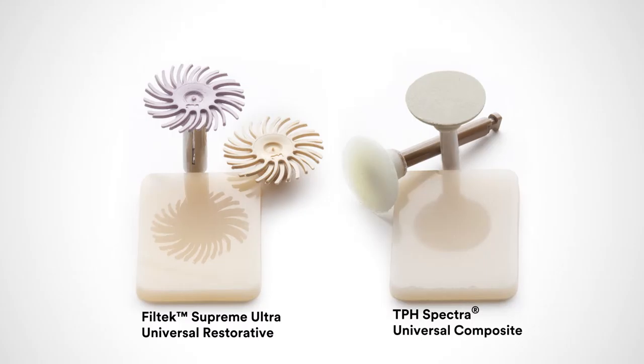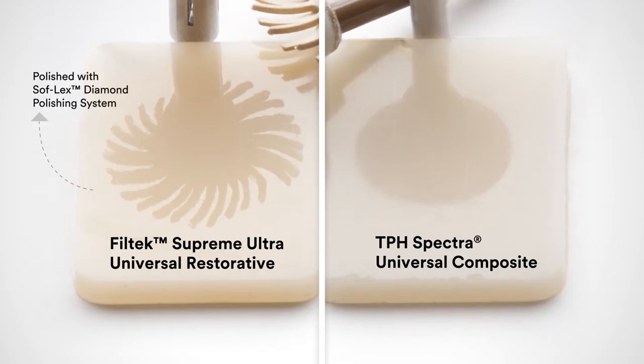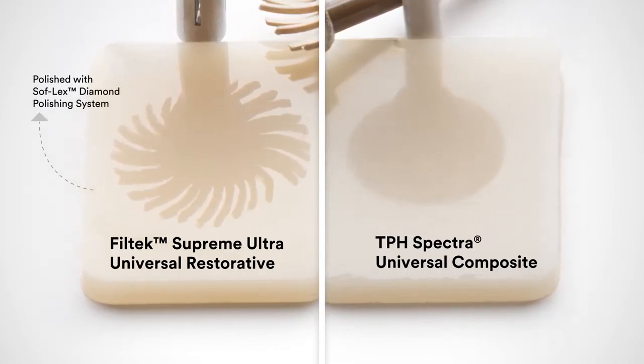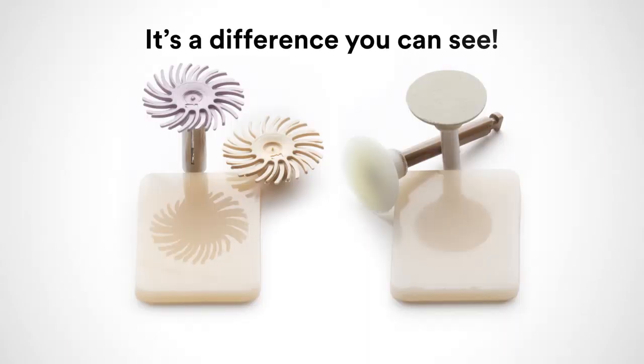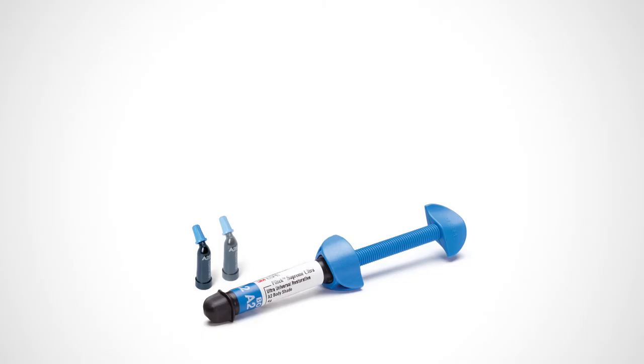The results — look at these polished samples of Filtek Supreme Ultra Universal Restorative and TPH Spectra Universal Composite. Note the reflection on the Filtek Supreme Ultra Restorative sample polished with the Sof-Lex Diamond Polishing System. It's much more clear than that produced by the enhanced finishing system and Pogo polishing system — it's a difference you can see.